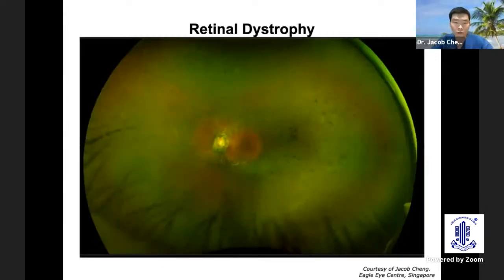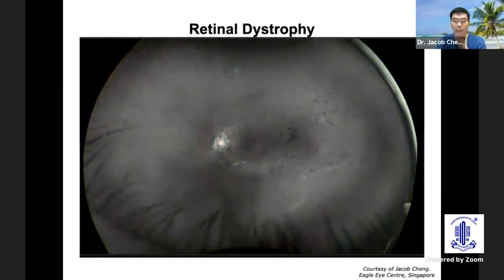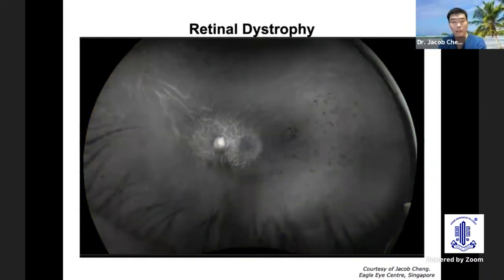Next patient, also retinal dystrophy, looks like retinitis pigmentosa with bony spicule pigmentation in the mid-periphery, but not as much as the earlier patient. But using the green channels, you can see the retinal atrophy. But on the red channels, you can see that the choroidal atrophy actually involves the posterior pole, even though the color and the retina did not show up very well.